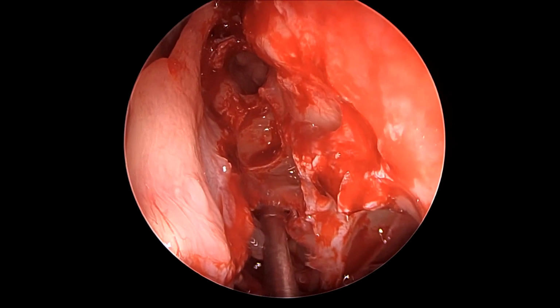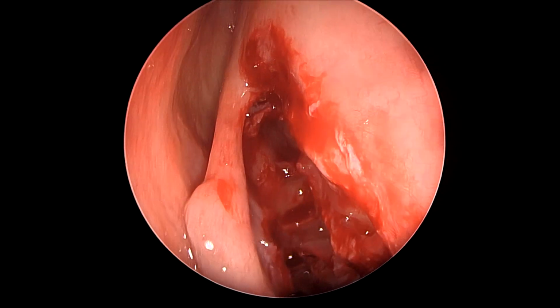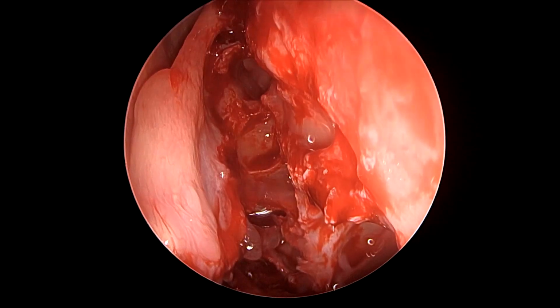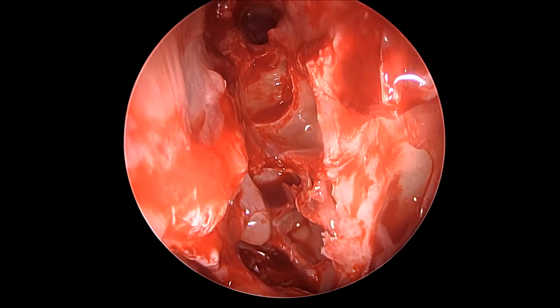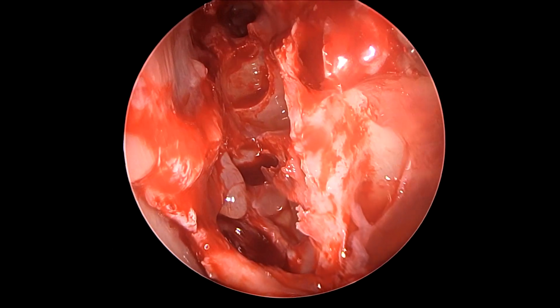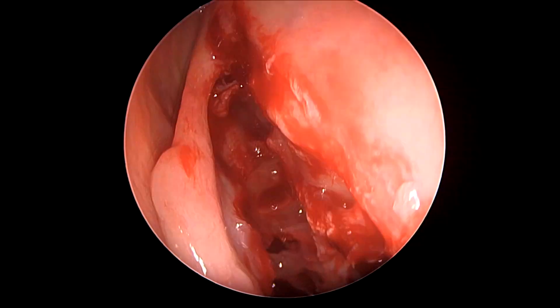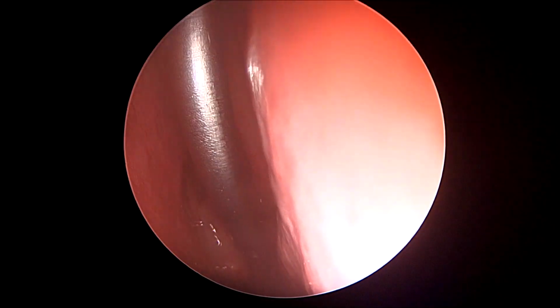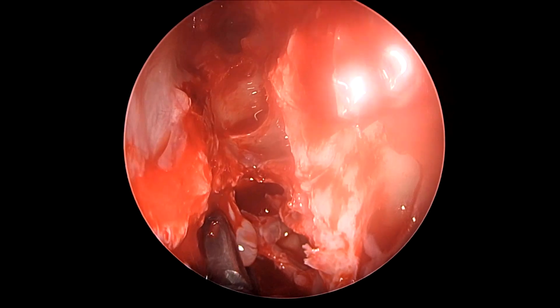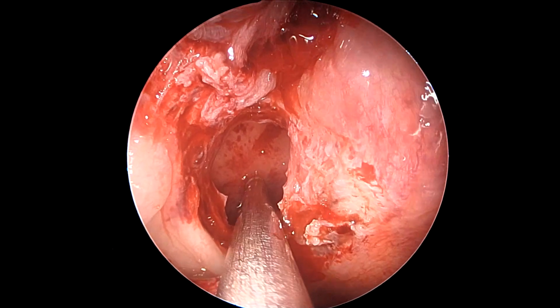Like you see here, the moment we open these posterior ethmoidal cavities, we did get out some polyps, even with a suction forceps, and now we can see how the ethmoidectomy cavity looks from below, with the maxillary sinus laterally to the right side, and the skull base from sphenoid to the frontal sinus from posterior to anterior, with almost all septations taken down, with a little polyp here. Now one must see how important it is to use the instrument with a 70-degree angled telescope. If you put the shaft of the instrument above the telescope, you cannot see, and the shaft of all the angled instruments must be below the angled telescope to be able to gather clear vision of the working part of the instrument.